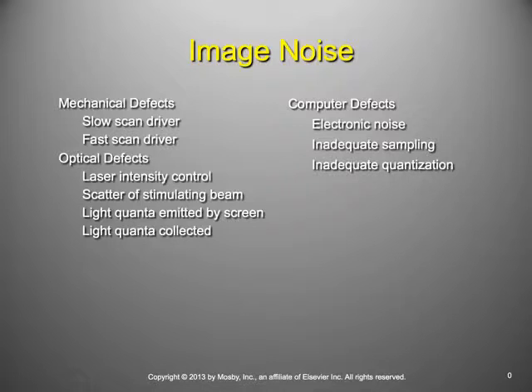He doesn't really talk about this in depth, but slow scan is the direction in which the image plate is fed through the reader. So typically it's the long axis of the image. It's going to be in the direction of the long axis. So this might be our slow scan direction, right? Then there's a laser that's very quickly going to go over this thing while it's being fed through the reader. And so the laser is going to go back and forth, and this back and forth of the laser we'll call the fast scan direction. So if you can imagine, it's slowly being fed through the reader while the laser very quickly moves across and is assisting with the reading.